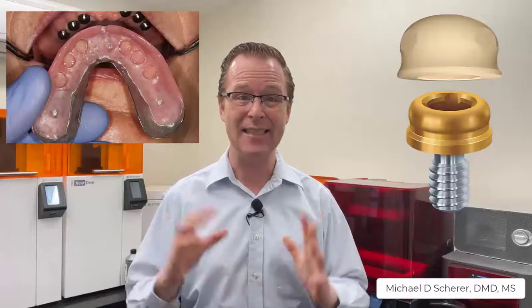The locator scan body is a pretty innovative tool in our toolbox for overdenture cases. It is a specialized snap cap that goes over the top of the locator abutment, which creates an ideal recess and geometry for our laboratories to design a digital denture, or even conventionally processed acrylic if we 3D print the models. It allows the laboratory technician to make a denture, either digitally or analog, on a digital or 3D printed model, so we can get a denture back in our office, see the patient, put the actual housings — the metal housings with nylon inserts — and it'll be a perfectly sized recess.